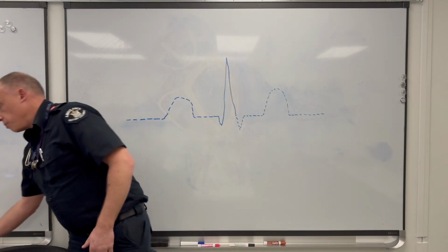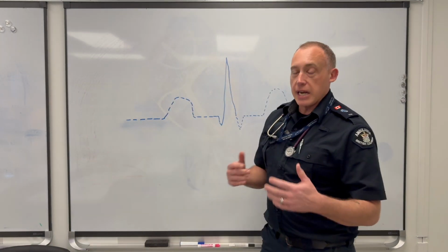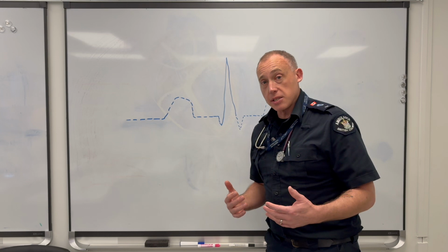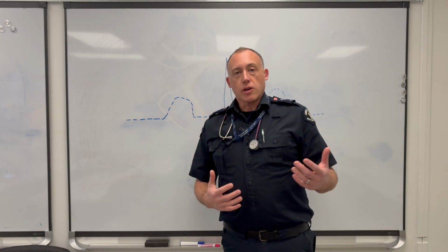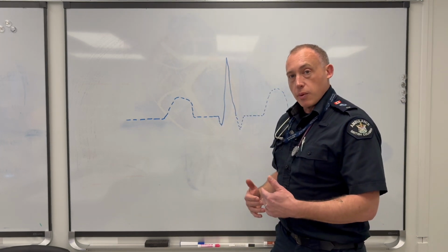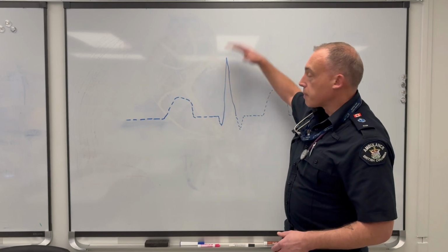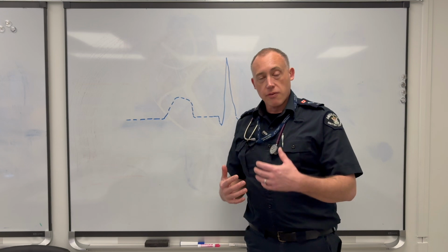And that's something to be aware of, and we'll talk about that when we get into more pathology, because the nature of the R wave and definitely the size of the R wave, including the width and the height, can suggest certain clinical problems. But all I really need you to know right now as we go through the PQRST basics is that the R wave represents the bulk of depolarization of the ventricles coming towards you when you look at it from a specific lead.